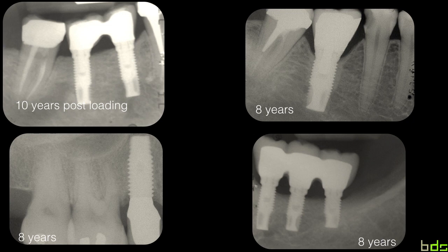And the same question I always ask myself when I see these cases, 10 years, 8 years post-implant treatment and post-prosthesis fixation, and you see no bone loss. I mean, literally no bone loss. And you always scratch your head and say, wait, but these are external hex implants. These implants should lose bone if we follow the literature. And a lot of the newly coming knowledge incriminates this kind of connection and this kind of macrogeometries, and they all blame it on the connection.